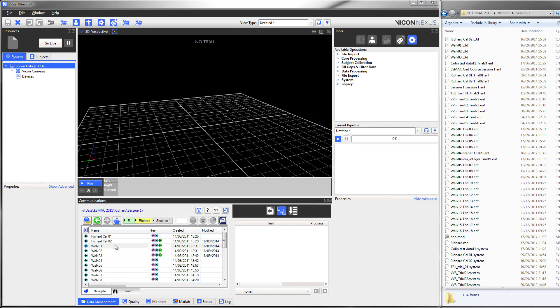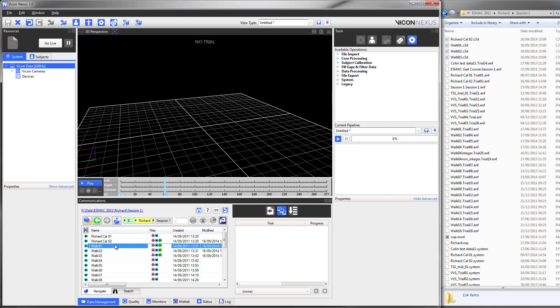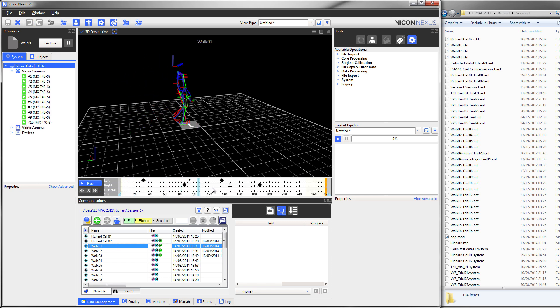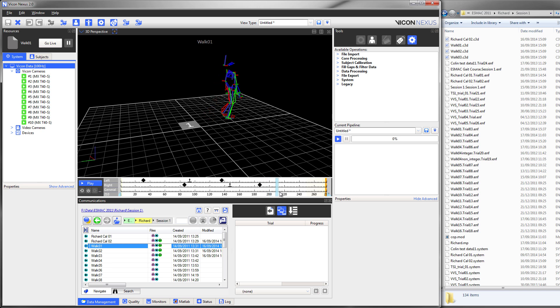One of the new and exciting features within Nexus 2 is the Python integration. Today I will show you a small script that allows us to export normalized data for a specific trial to PDF.